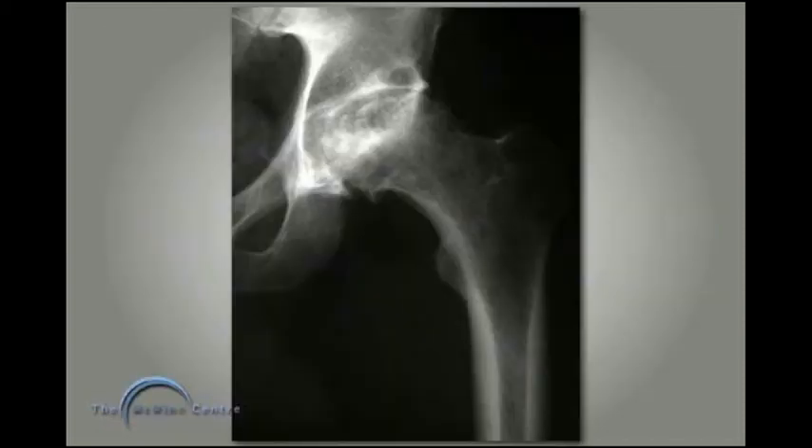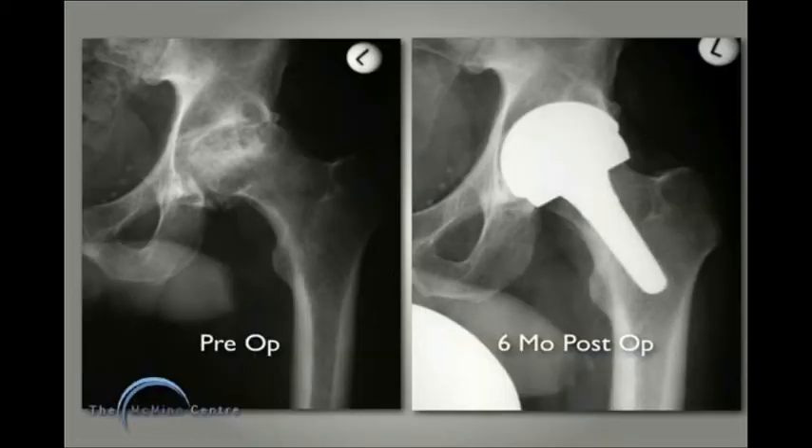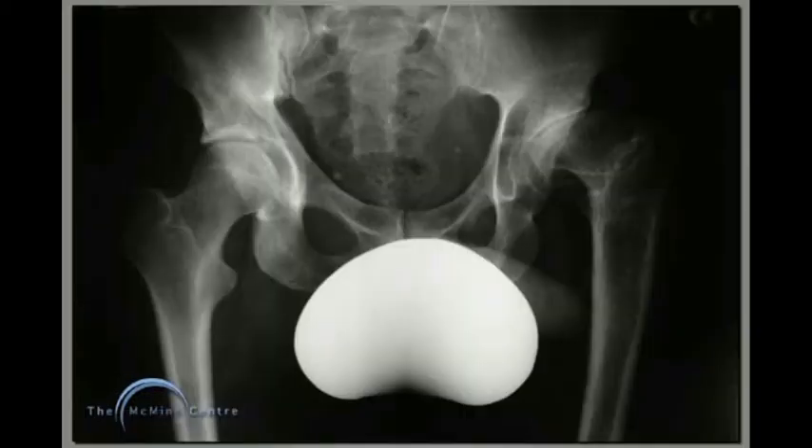Here's a patient whose left hip has severe osteonecrosis — too extensive for hip resurfacing. The template for the size 4 BMHR stem shows the alignment we're aiming for. On the six-month film, everything looks great and the patient is delighted with his hip.